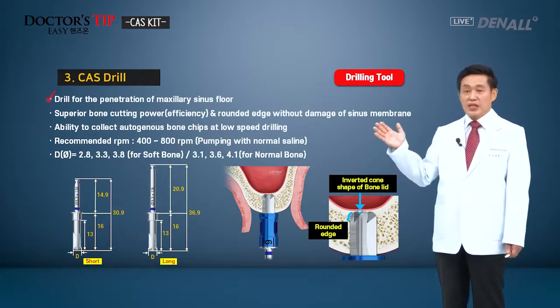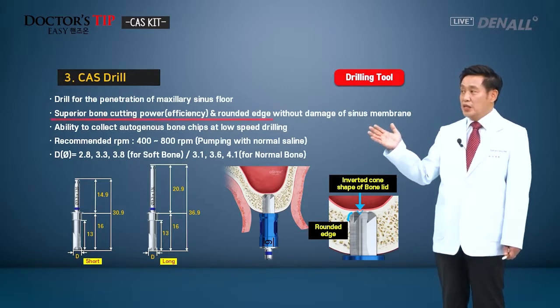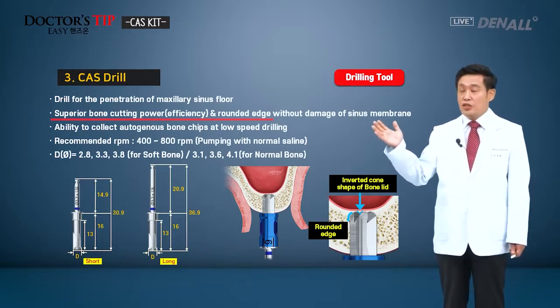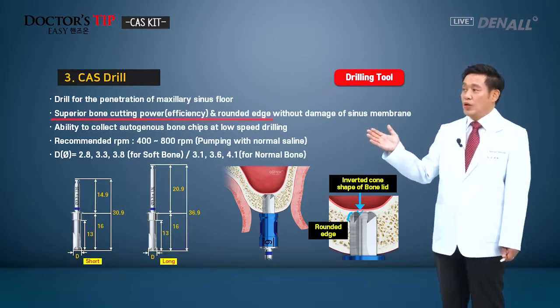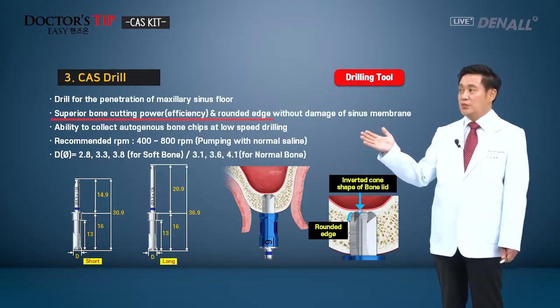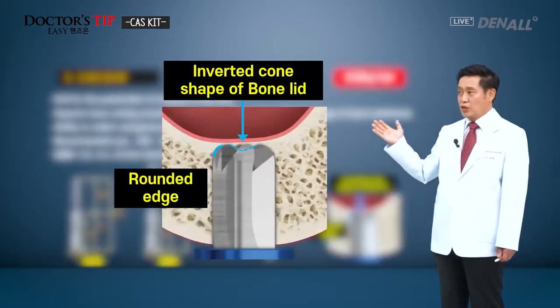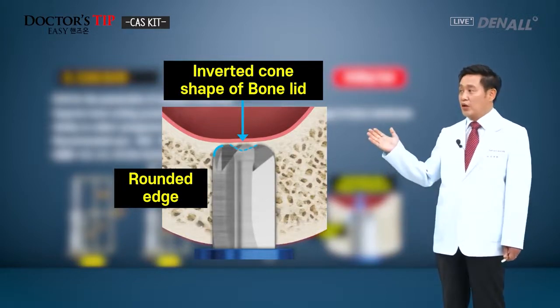CAS drill, basically it is designed to penetrate into the maxillary sinus floor. As I said before, its edge is rounded and has very good cutting efficiency, so without damaging the sinus membrane, you can penetrate into the sinus floor. That's how it is designed. At the top, it has the inverted cone shape of a bone lid, which is designed to minimize the damage to the membrane.